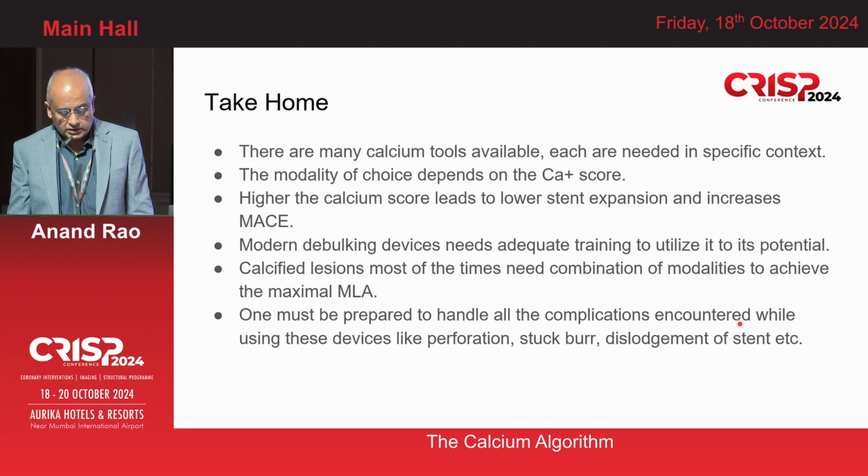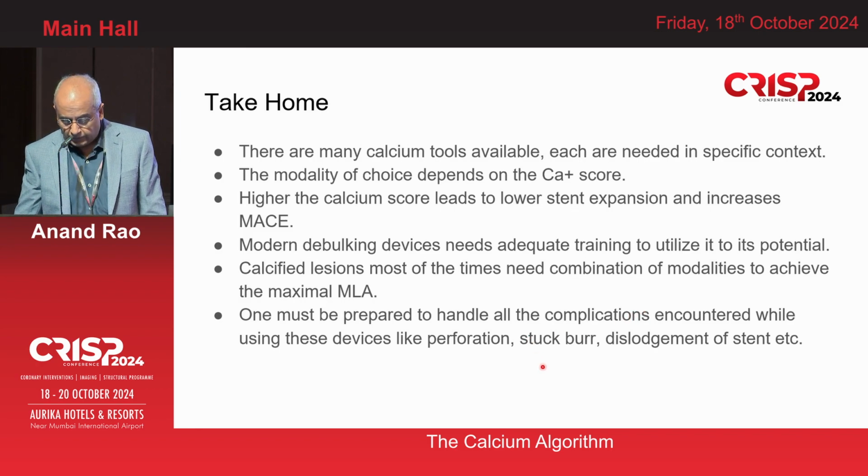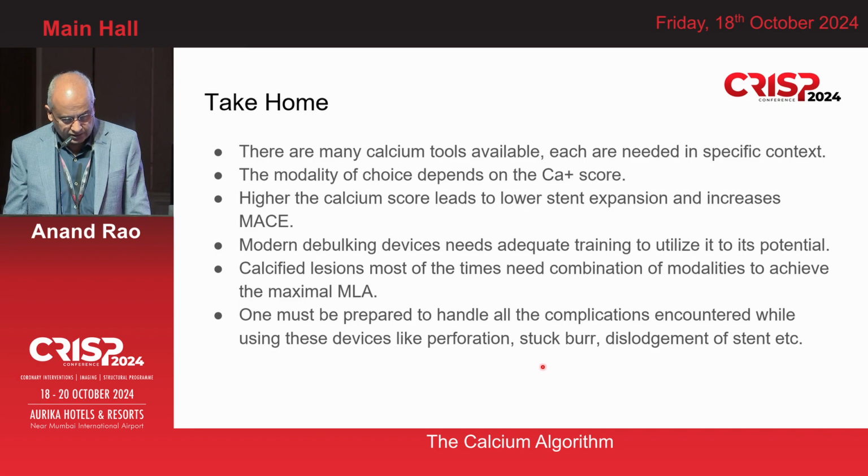Modern debulking devices need adequate training to utilize them to their potential. Calcified lesions most of the time need a combination of modalities to achieve the maximum MLA. One must be prepared to handle all kinds of complications encountered while using these devices, like perforation, stuck burr, dislodgement of stent, etc.